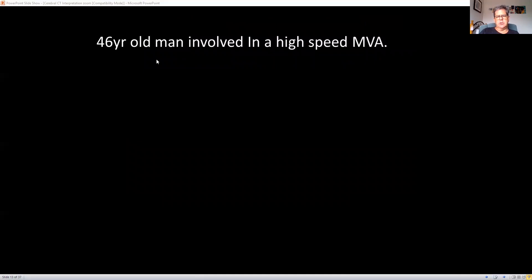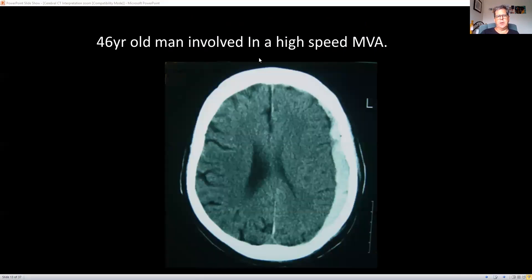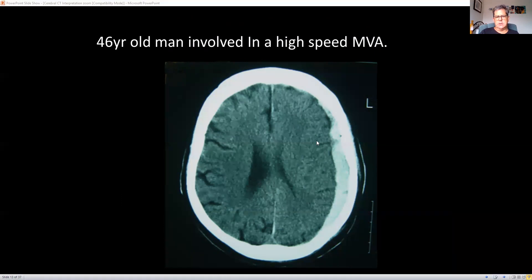A 46-year-old gentleman involved in a high-speed MVA — obviously an acute subdural. You often have to take a second look with these subdurals because you can sometimes see the effects before you actually see the subdural itself. You can see there's CSF inside the sulci on one side but it's pushed out on the other side. The lateral ventricle has been effaced with a bit of midline shift. Then looking secondarily, you can see that long, broad, crescentic-shaped acute subdural.